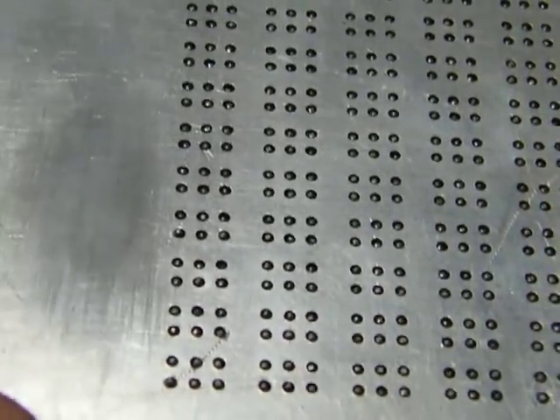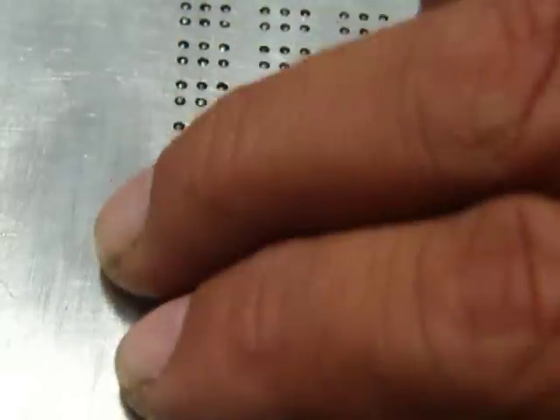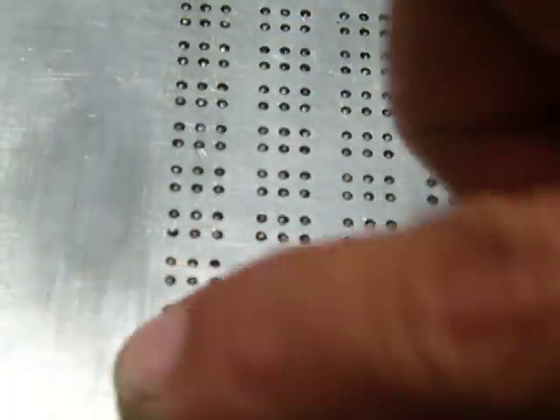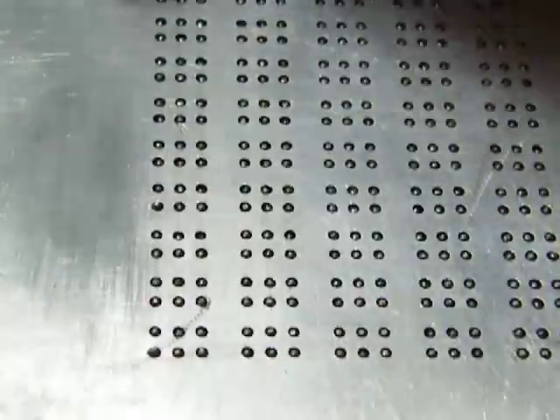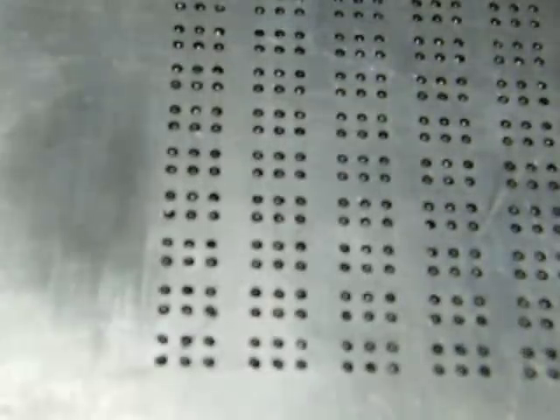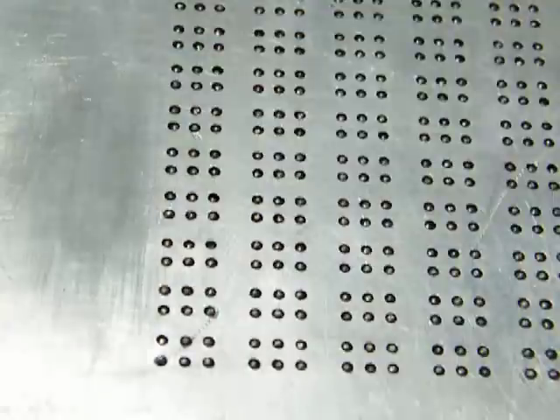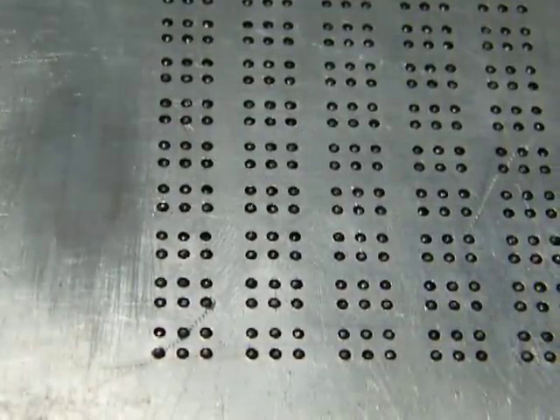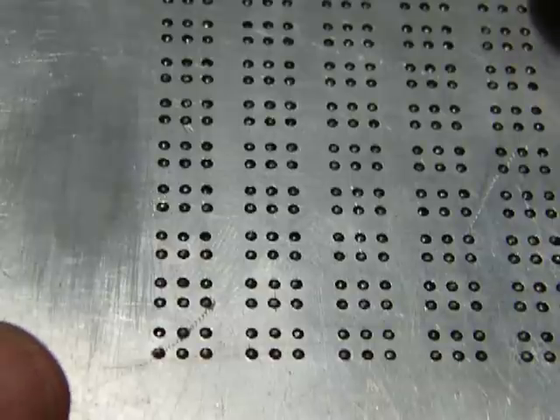So the one characteristic is once a pin is latched in a particular position, the latching is very strong, very firm. You can press as hard as you like over here. You can take any amount of finger pressure, nothing happens. And as I showed in the other video, you can actually use this as a Braille embosser. Put a piece of paper over the top and rub your finger over it, or a rubber wiper, and you get your Braille impression on the piece of paper. So that's basically how these row and column actuators work.